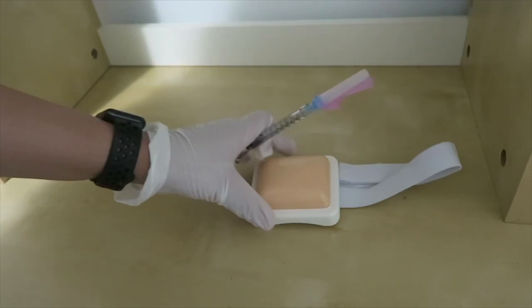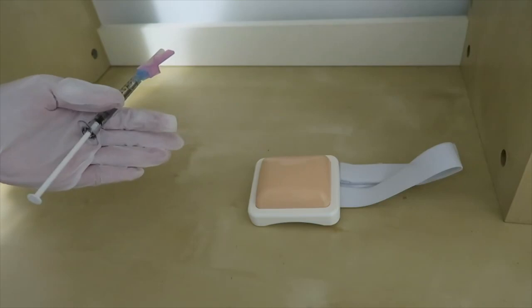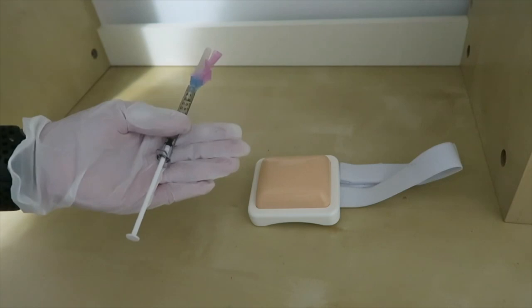So as mentioned, I will be administering into the deltoid. However, before I do so I need to ensure that I have the correct patient. To do that, I will take 2 identifiers from their ID band. In this case, it will be the date of birth and their full name.